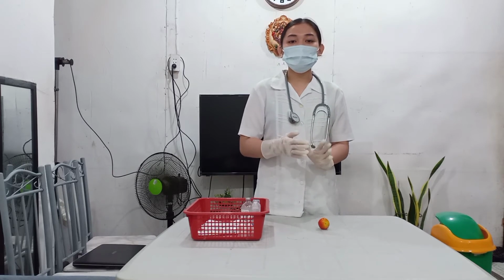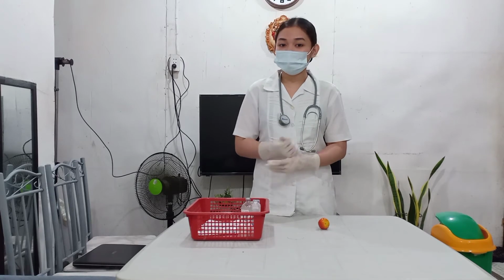Now we select a site for injection because good visualization is necessary to establish the correct location of the site and to avoid damage to tissues.